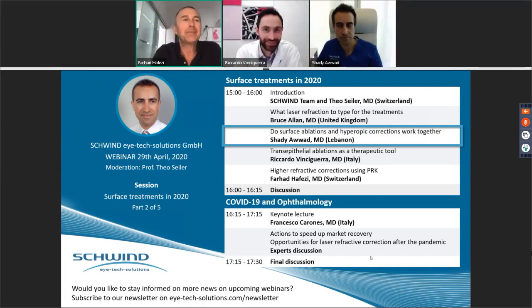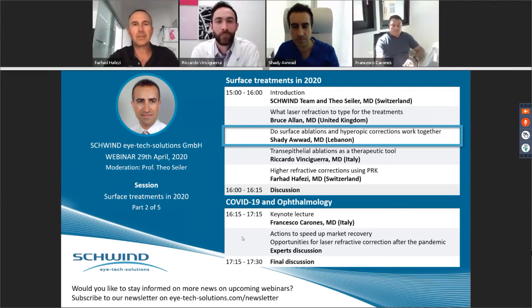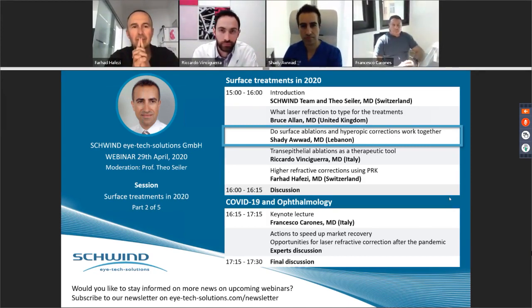Yeah. The last question for this talk, otherwise we are running out of time, goes to the technical guys. So Sam, what about the transition zone? Obviously, it plays a role in the remodeling, at least of the epithelium, maybe not in the stroma. Can we now adjust the transition zone in hyperopia corrections out to 9 millimeters regularly, or is there some limitation?